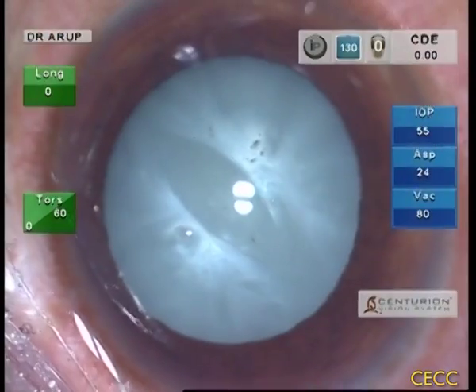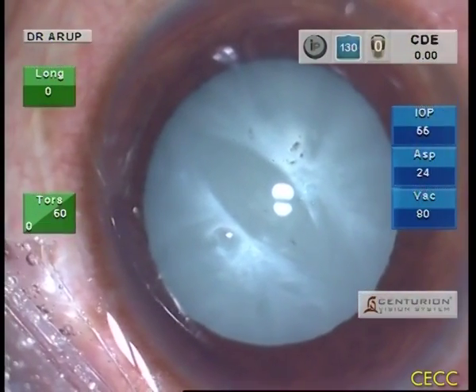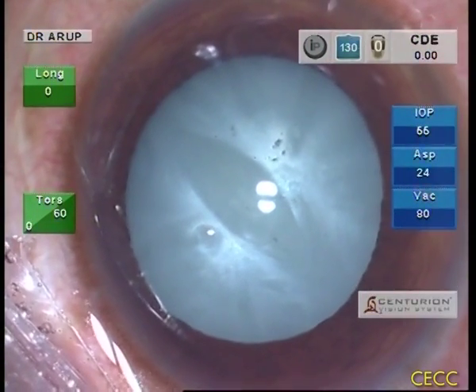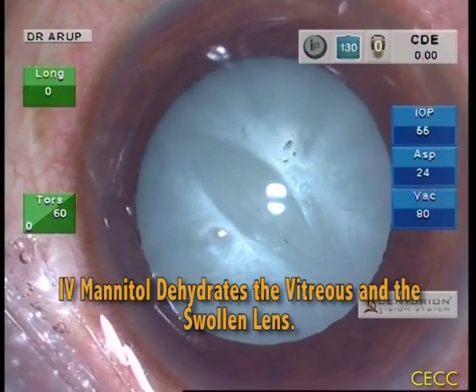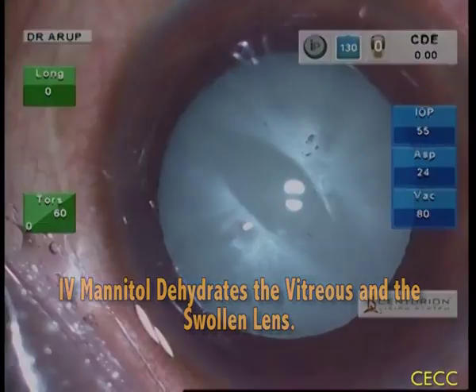Pre-op IV mannitol was not used in this patient. However, I routinely use 20% IV mannitol pre-operatively for white swollen cataracts with shallow anterior chamber in non-vitrectomized eyes. IV mannitol is known to dehydrate the vitreous and a few colleagues feel it even dehydrates the swollen lens.